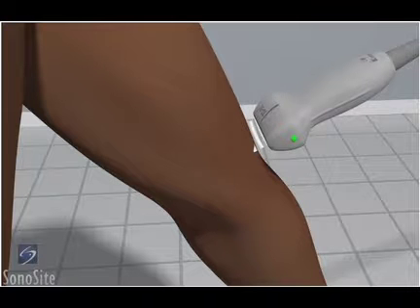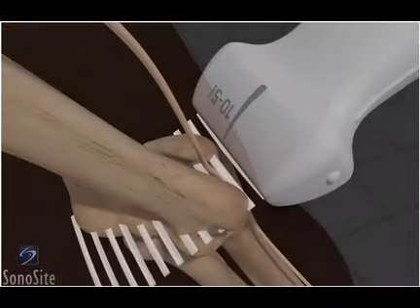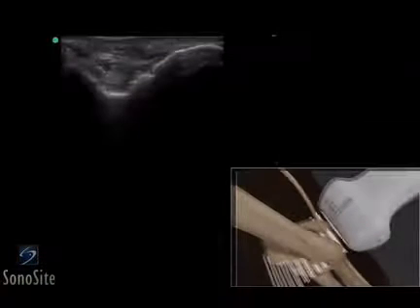The transducer is placed over the posterior medial elbow in a transverse fashion with the orientation marker directed toward the patient's right.